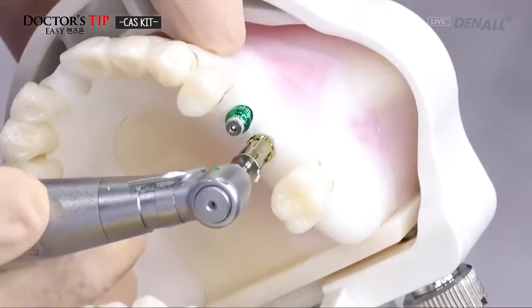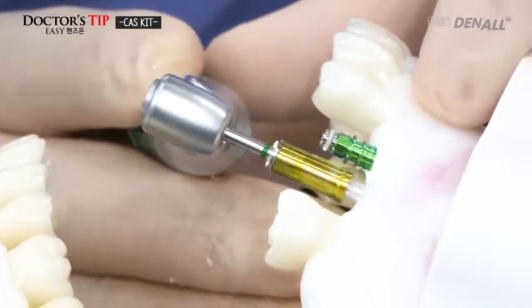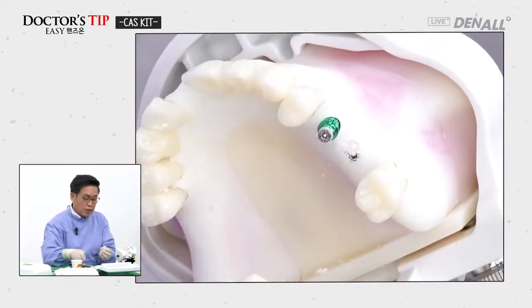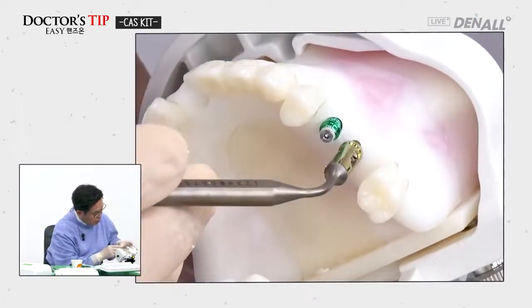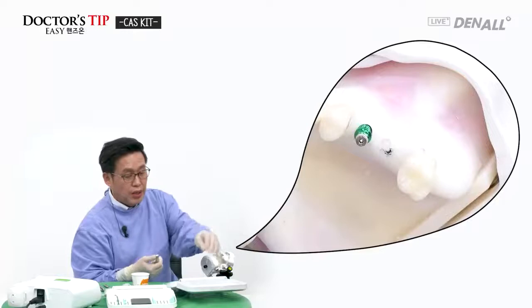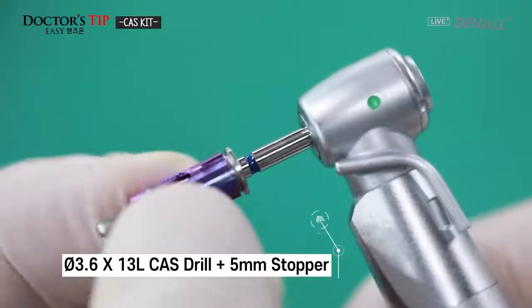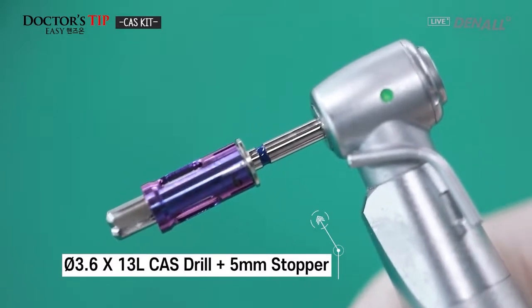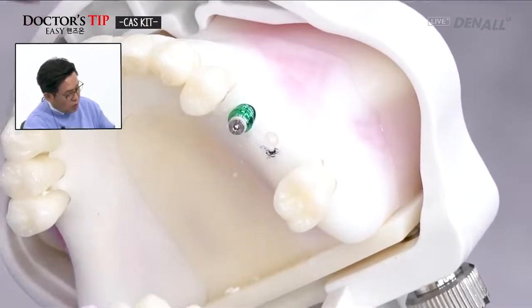The 3.1 and 4 millimeter stopper. 4 millimeter drilling is done, and the depth gauge is connected with the 4 millimeter stopper to check whether the sinus floor is penetrated. It's not penetrated yet. Next, 5.0 will be done, but first the 3.6 CAS drill and 5.0 millimeter stopper is connected. The CAS drill is increased by 1 millimeter in diameter and in the length as well.